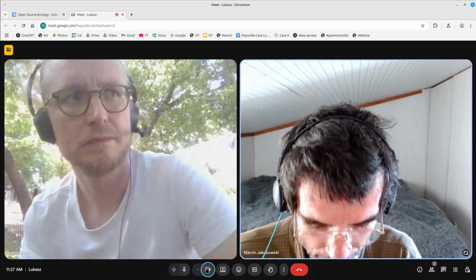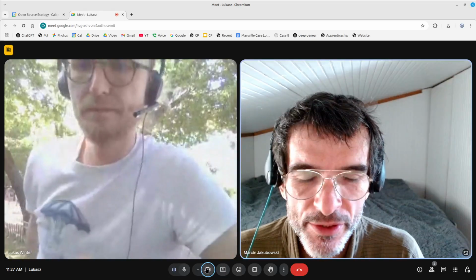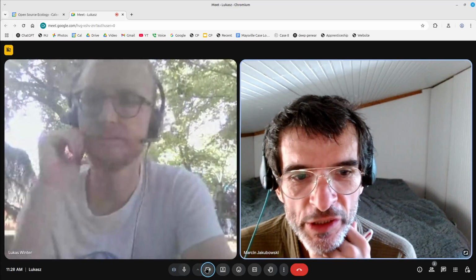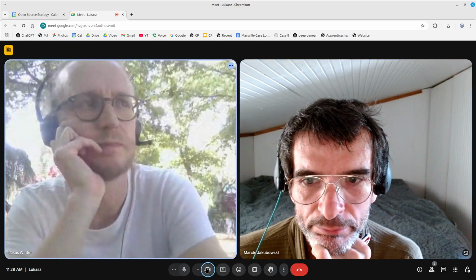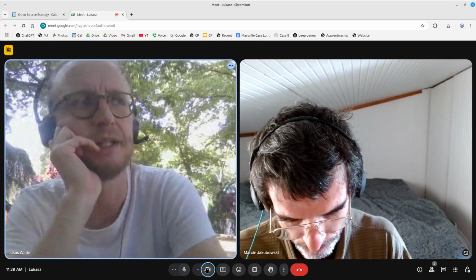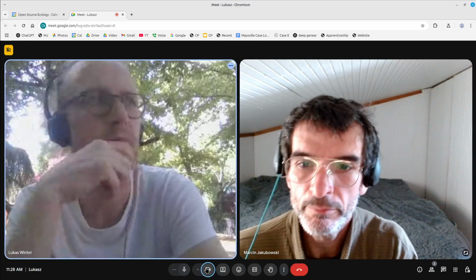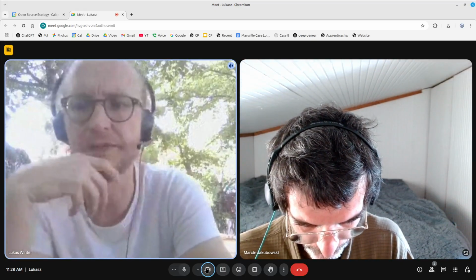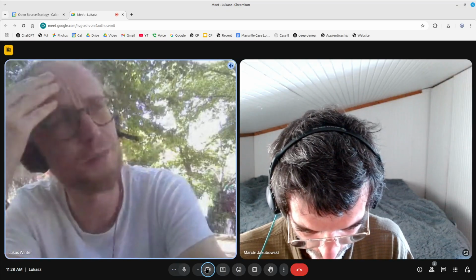You mentioned 50K in hardware, plus developers and software, plus 50K in clinical studies. So one product, one iteration would be like 100K just in those costs plus development time. Probably a bit more. The test I was talking about is really just two parts. There's the medical device standard 60601-1, which is just the safety part for the hardware itself, and then you have the 60601-2-33, which is MR specific.